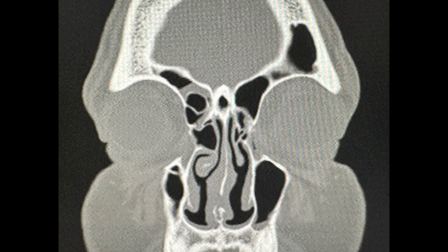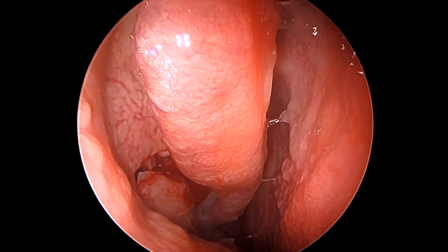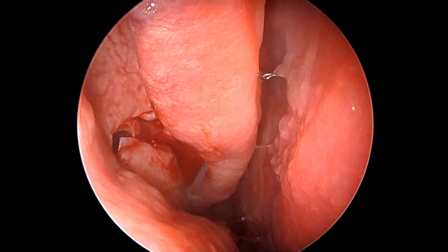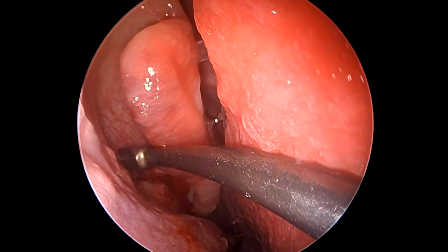So understanding the frontal sinus anatomy on a case-to-case basis is very important in successfully opening the frontal recess or the frontal sinus, especially in patients where there is selective opacification or sinusitis of the frontal sinus, because merely opening the ethmoids or the sphenoid would not lead to complete relief in these patients. Not understanding the anatomy of the individual cells, the blocks that make the frontal recess, whether it is Kuhn cells or suprabullar cells, can make the frontal sinus approach very difficult and inconsistent and give rise to unsatisfactory outcomes after sinus surgery.